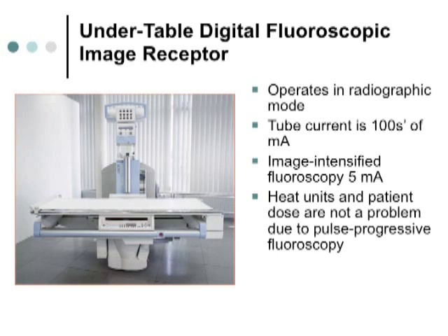With normal X-ray, we usually use 100 MA or higher with a static X-ray. With a fluoroscopic image, we're using continuous exposure at very low MA and high KVP. But the X-ray machine is pulsating consistently, 360 times per second with 3-phase 6-pulse unit. The newer units, we're going to use a higher MA but less pulses, which you'll see in a second.